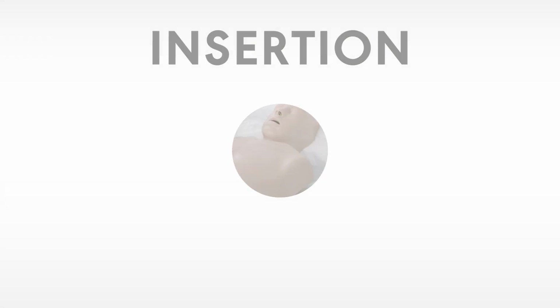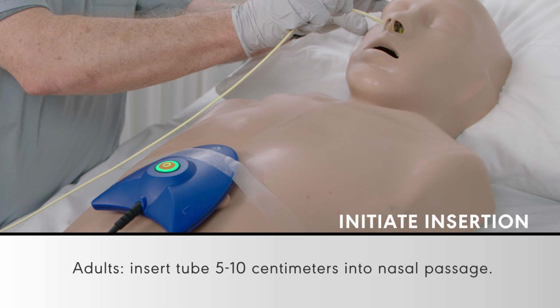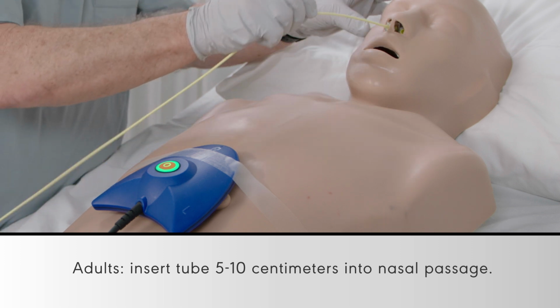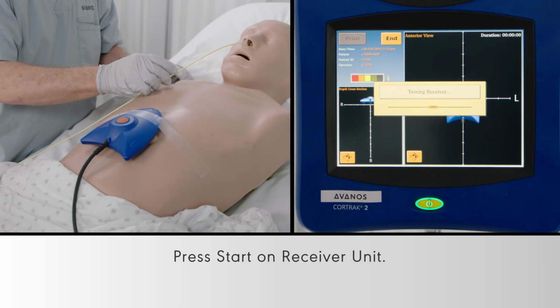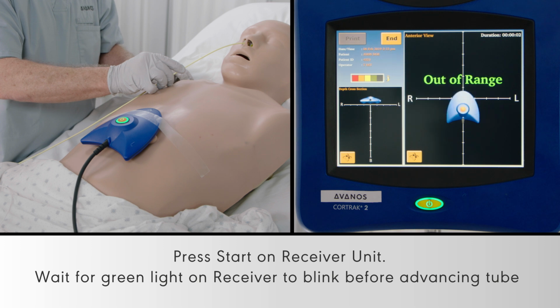Insertion. Warning: the CORTRAK 2 does not replace the need for vigilant clinical assessment during the feeding tube insertion procedure. To initiate insertion for adults, insert the tube 5 to 10 centimeters into the nasal passage. Press Start on the receiver unit. Wait for the green light on the receiver to blink before advancing the tube.